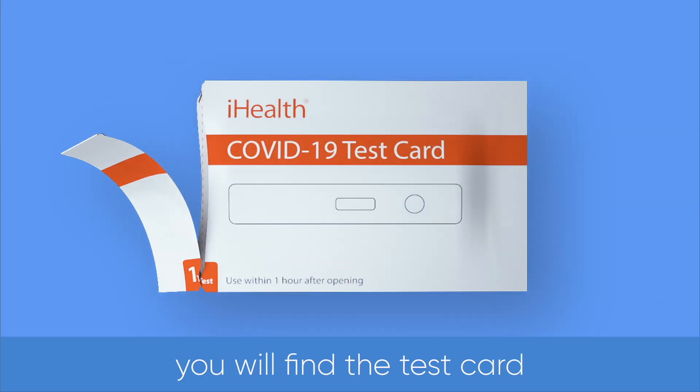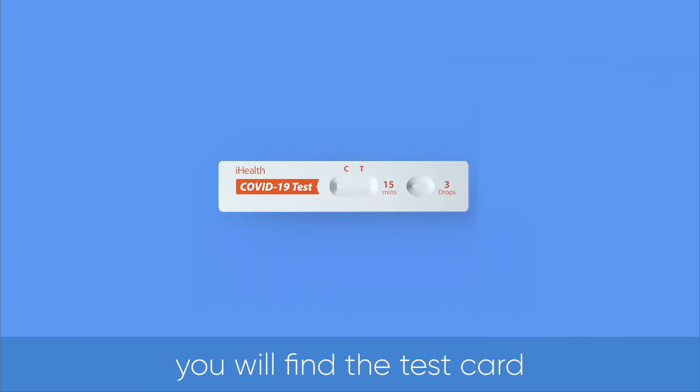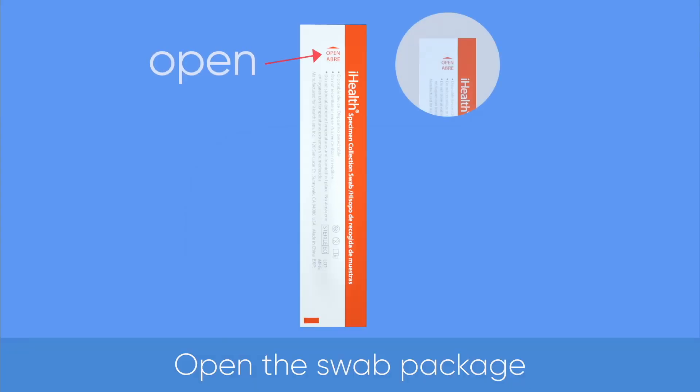Open the foil pouch. You will find the test card. Open the swab package.